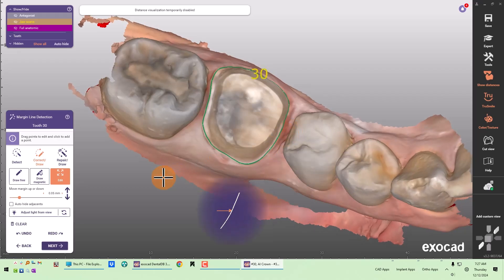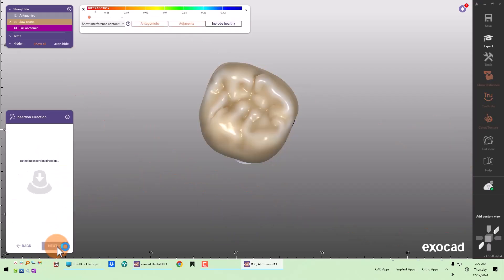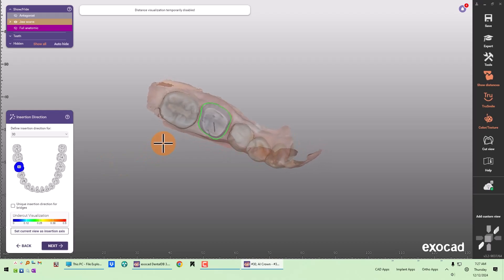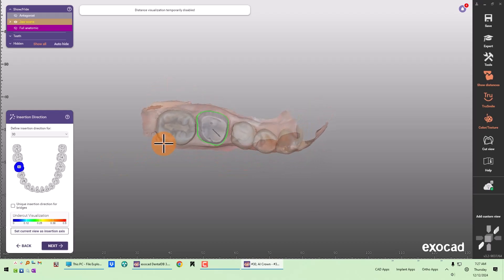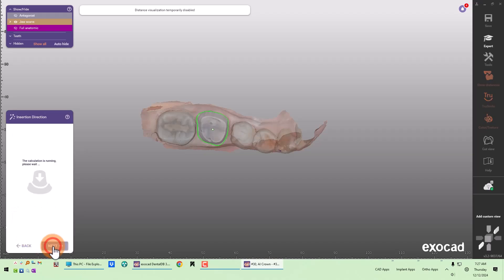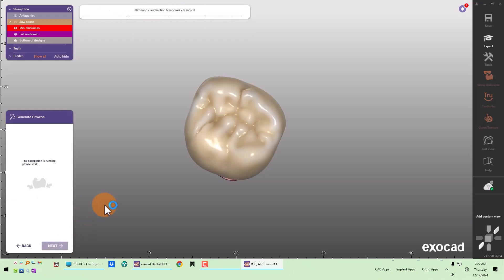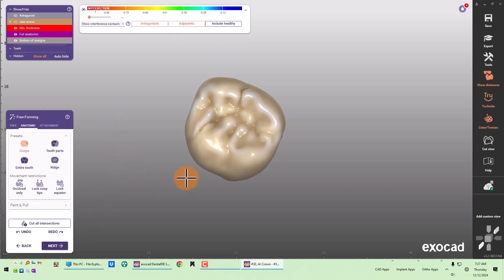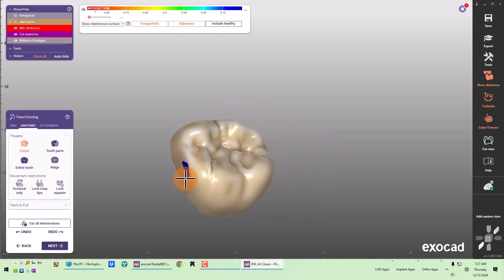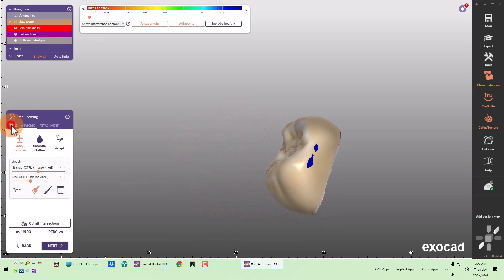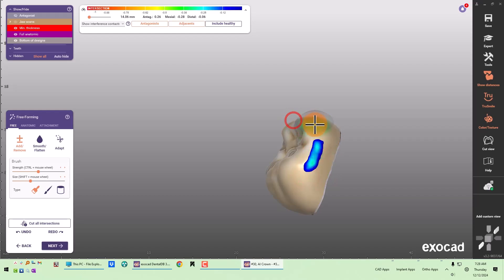Margin looks good to me. I like to determine the insertion direction because I want to eliminate undercuts on the proximal surfaces, so I normally change the insertion direction, but you don't have to. I've got all of my crown bottom parameters already preset and I've already determined the appropriate shape for the tooth. I like to bulk up my proximal contacts to make sure I have a good, strong, broad contact.